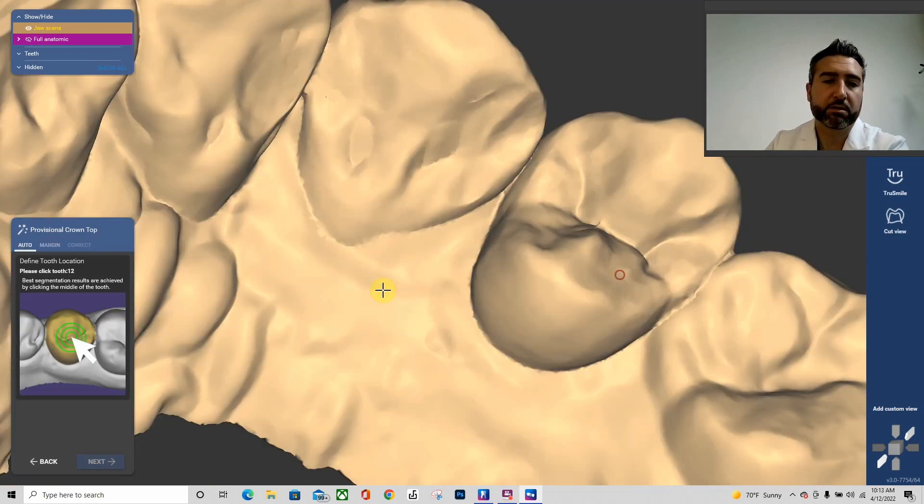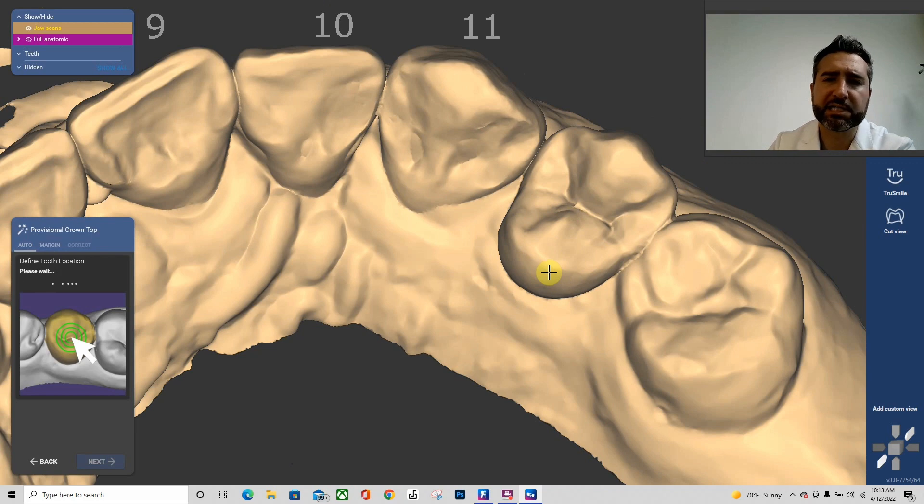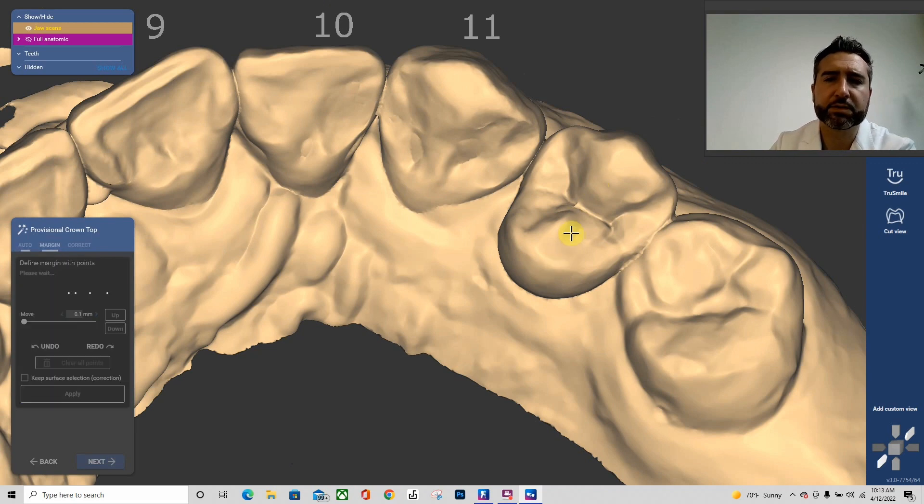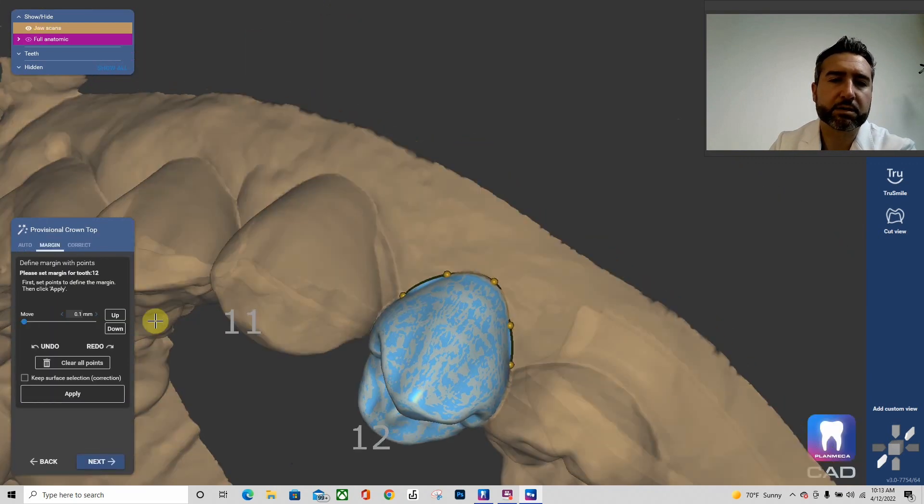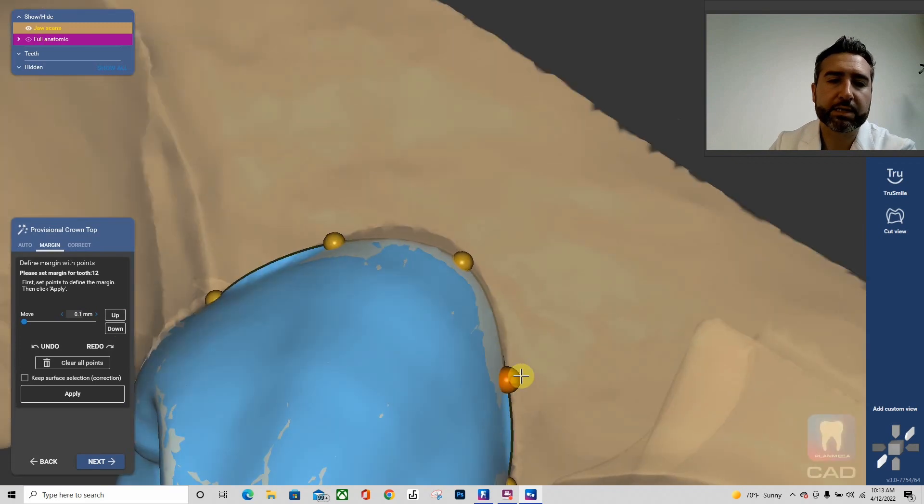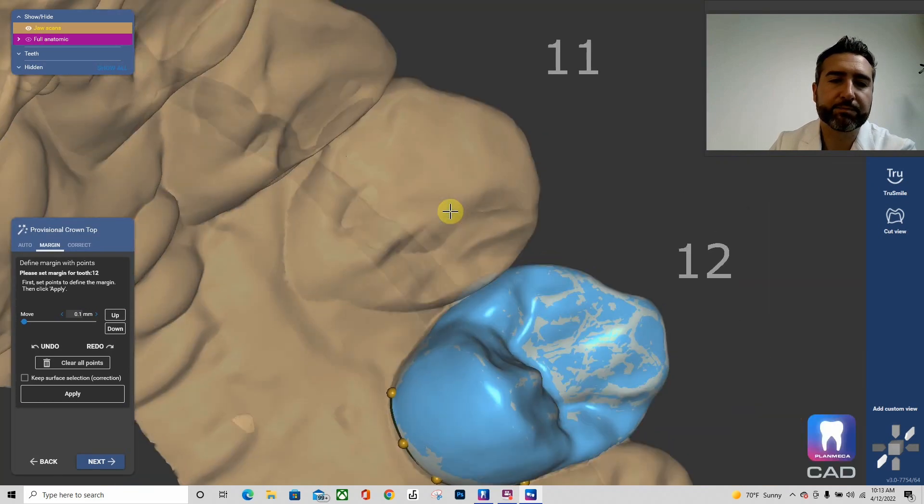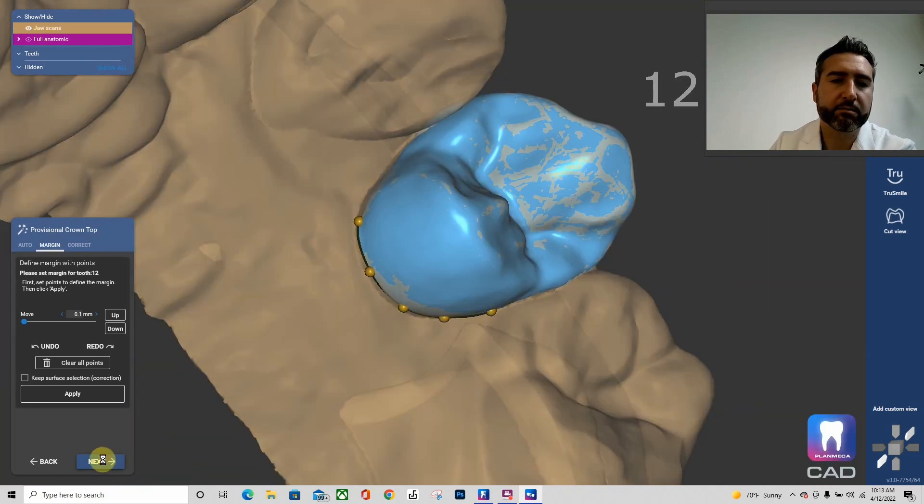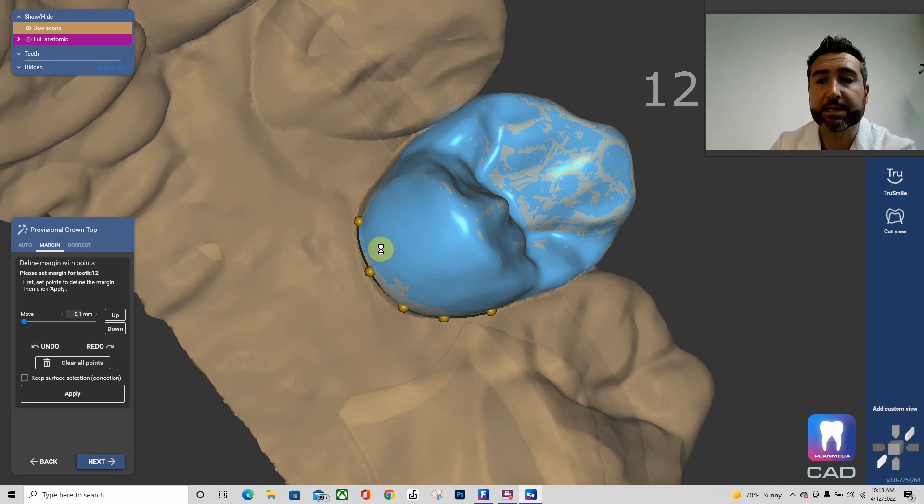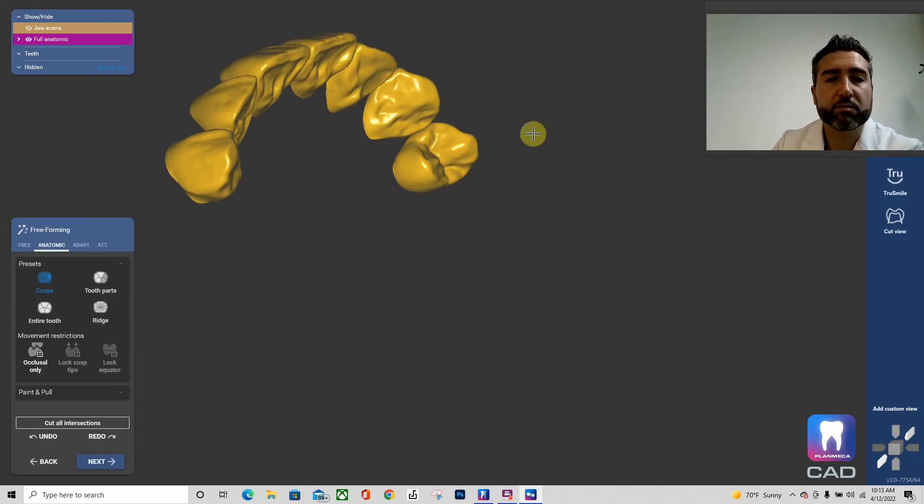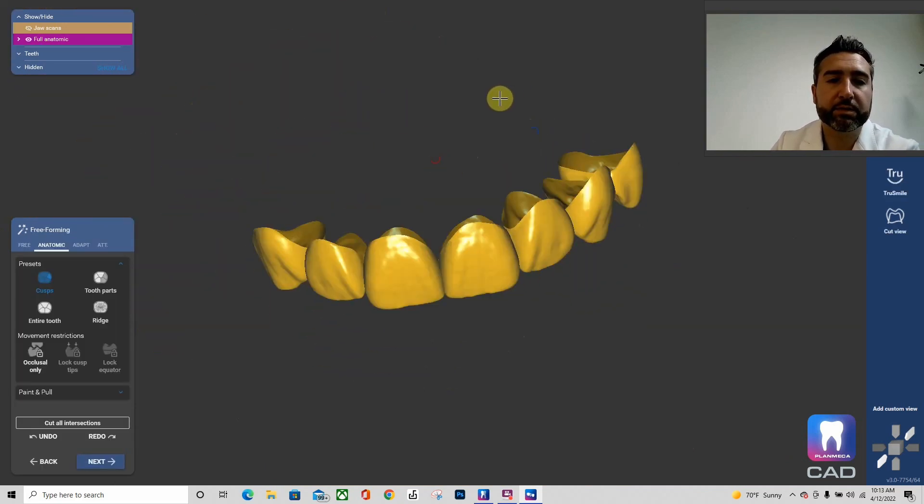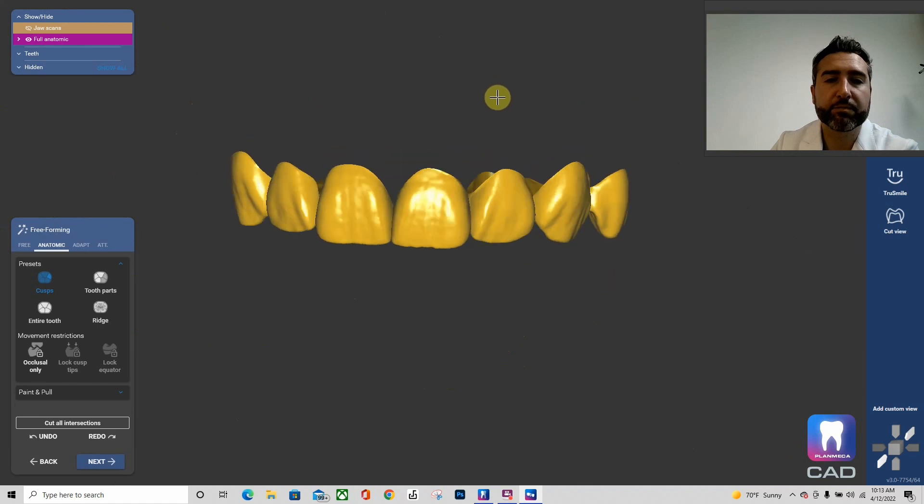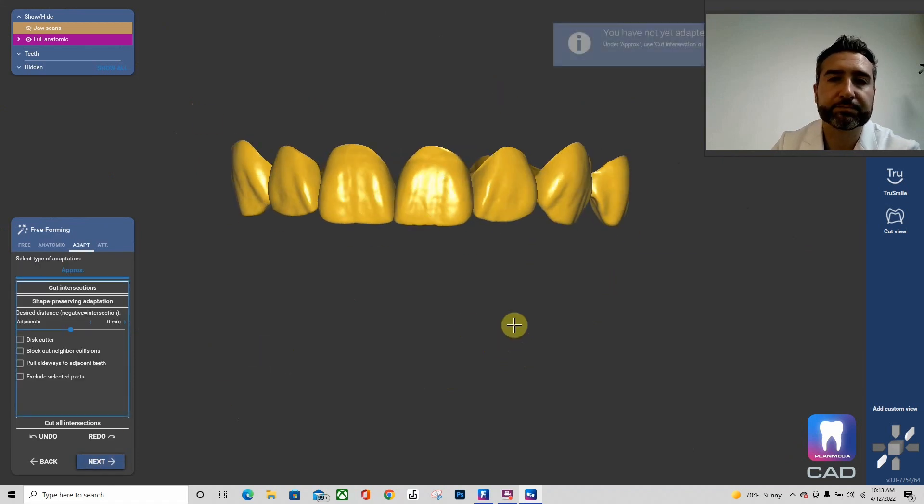And proceed on the wizard. So you're just literally clicking each tooth, that does auto segmentation, bump it up a few times and hit next, checking to make sure that those balls are within the outer layer of the tooth shell or more protrusive, more bulky. Like again, never want it in, you want it out. Bump it up a few times, hit next. And I'm going to come over here, and I think this is my last one. I think we'll just do a simple case like this. Don't like how that's curling out, so I'm going to bump that out there.